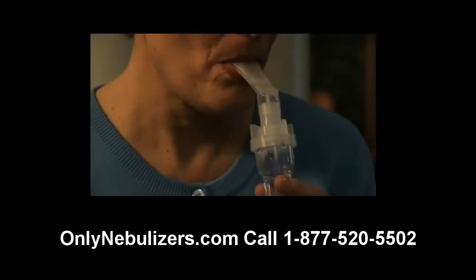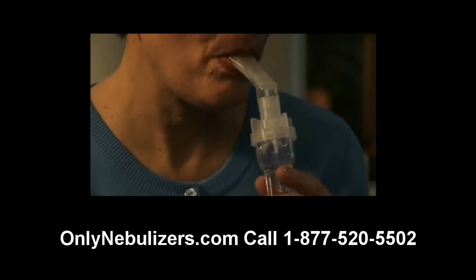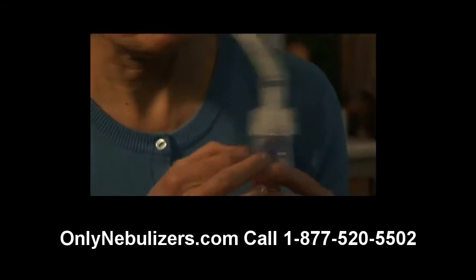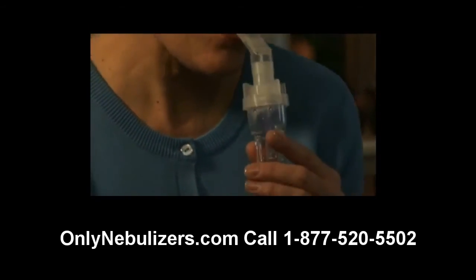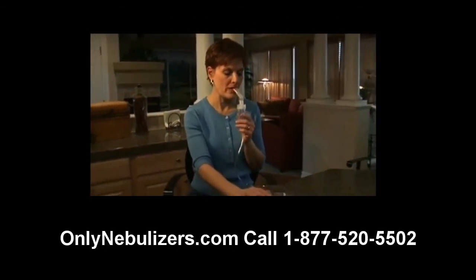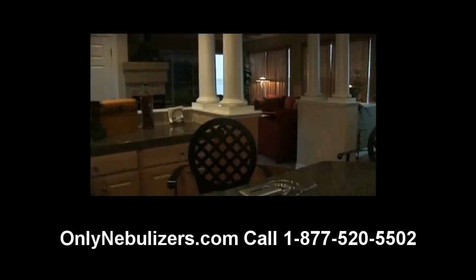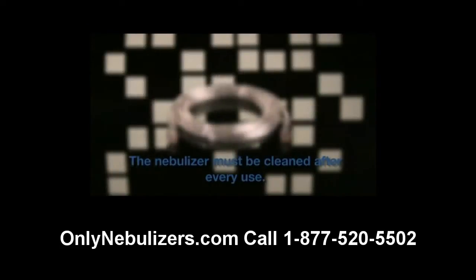Please note that medication can collect on the sides of the nebulizer during treatment. If this happens, gently tap the nebulizer and the medication should drop back into the cup. When you've completed your treatment, turn off the compressor and unplug the unit from the wall power outlet and power socket on the unit. Without exception, all parts of the nebulizer except for the tubing must be cleaned after every use. The inside of the tubing does not have to be washed because only filtered air passes through it.